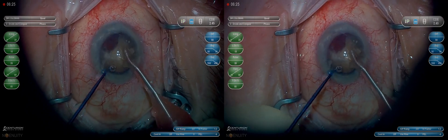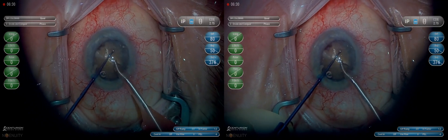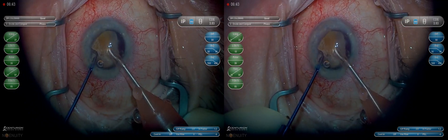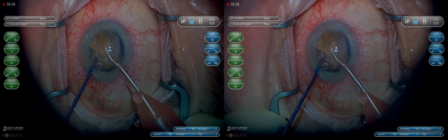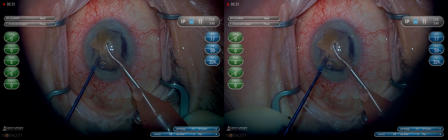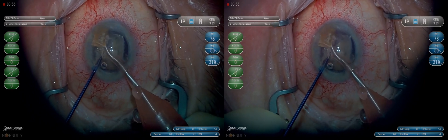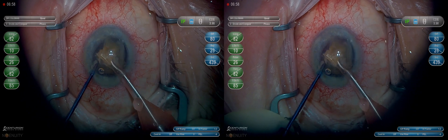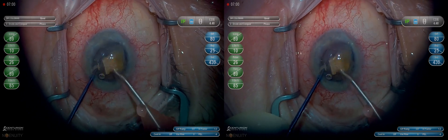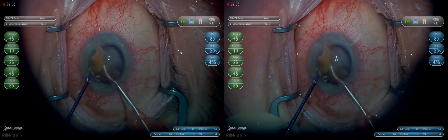We'll bring the second quadrant up into the anterior chamber and actually break it into a slightly smaller piece since the lens is extremely dense. It's important to note here that you still have a hemi nucleus in the capsule bag that's protecting the posterior capsule, so it's not particularly important to hold your second instrument deep. That gets progressively more important as you remove more of the nucleus and there's less to hold the capsule back from touching the phaco tip.